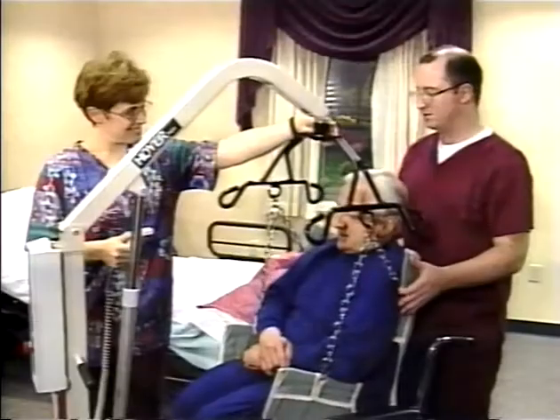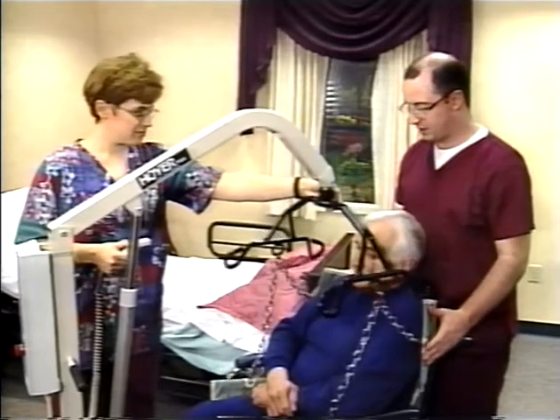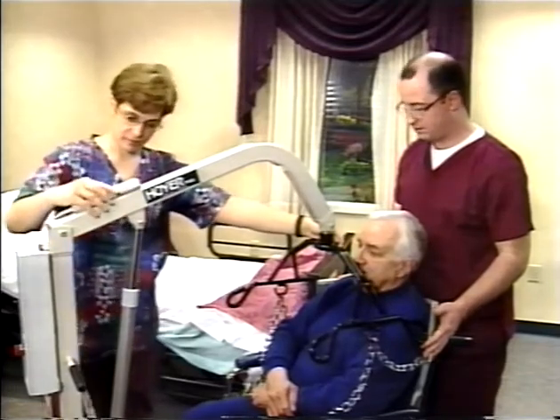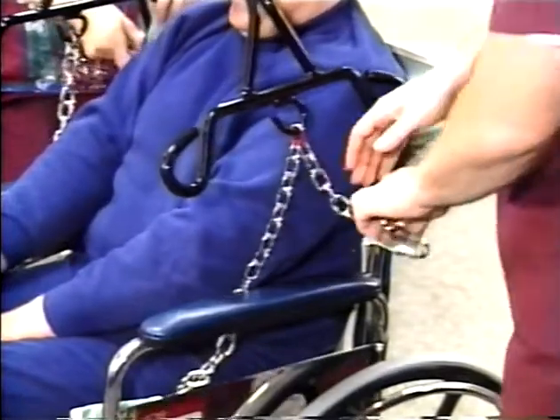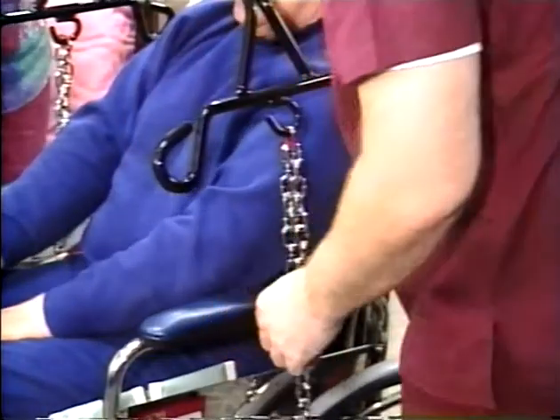Just before he makes contact with the chair, gently lift on the back of the sling or press down gently on his knees with your free hand. This will help him get seated in a comfortable upright position. Now, lower the cradle until there's no weight on the chains. Unhook the chains from the sling, then slightly raise the boom to assure safe headroom, and remove the lifter.